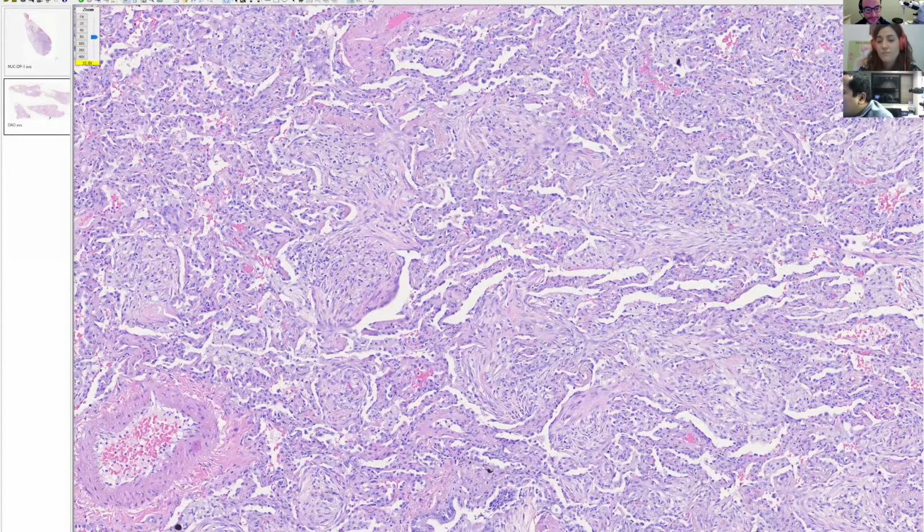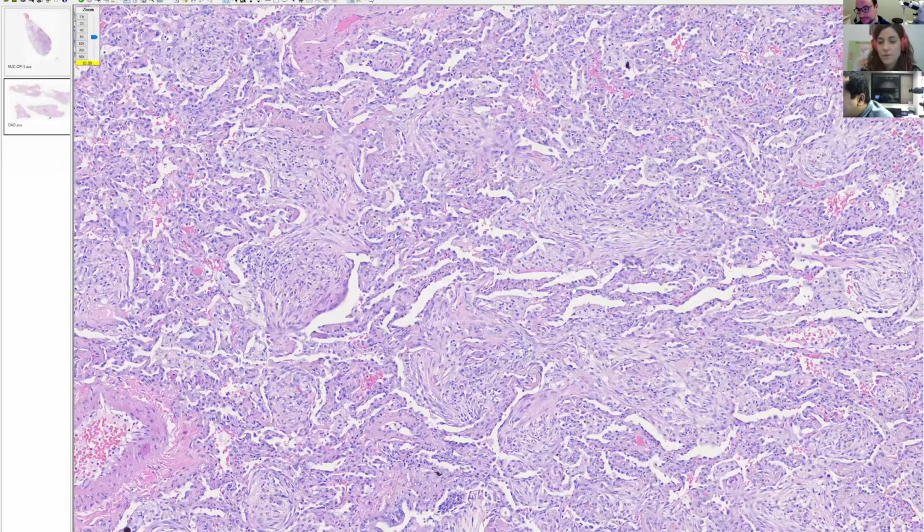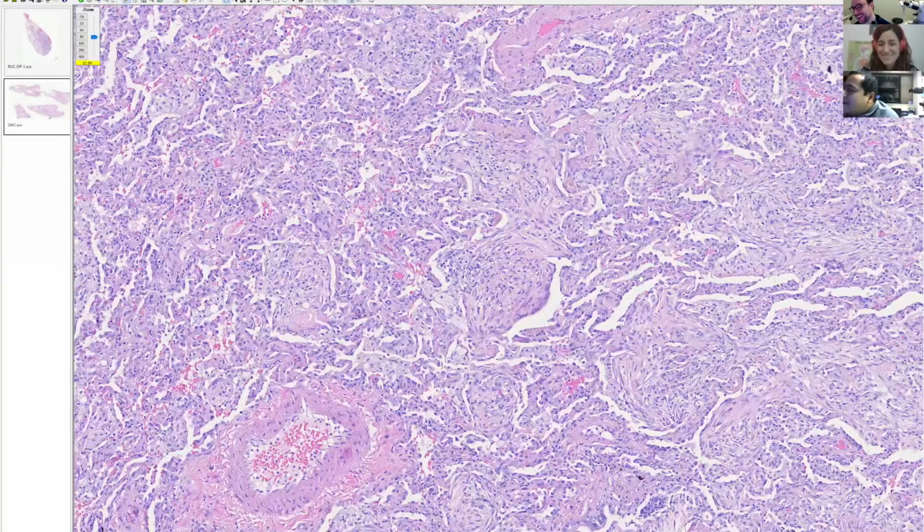Irene, do you want to take that? Do you do bug stains in these organizing pneumonia cases? I used to do silver in the past, but I don't do this anymore, because I never find anything unless there is necrosis or something like that. I never find anything interesting. Matt, how about you? Let me put a specific question to you: pure OP and nothing else, just garden variety OP, no granulomas, no necrosis, and you do your AFB and GMS. How often have you had a hit? Probably zero. Mine has been zero too. I still do it though.